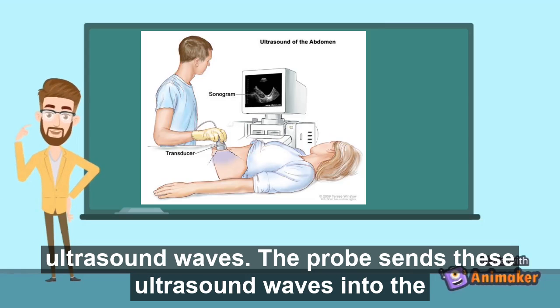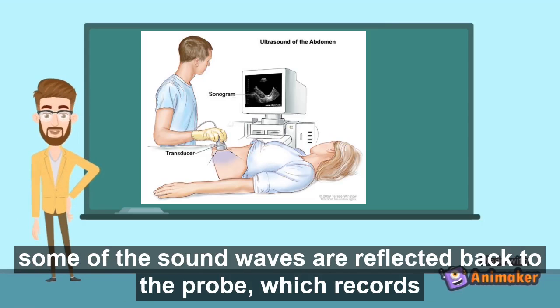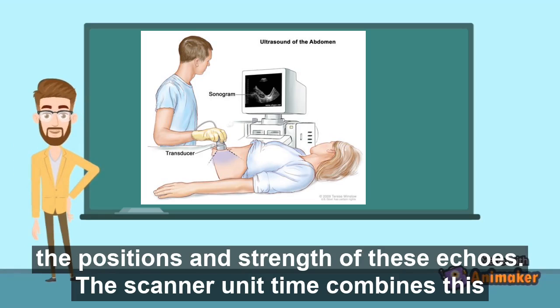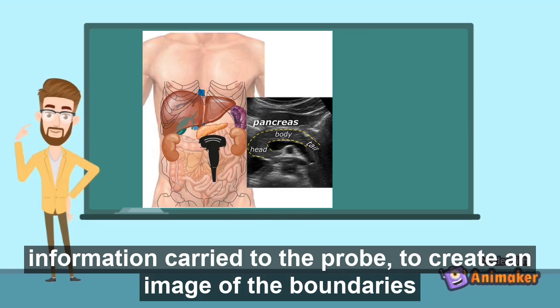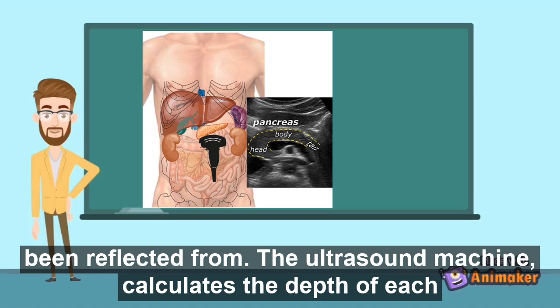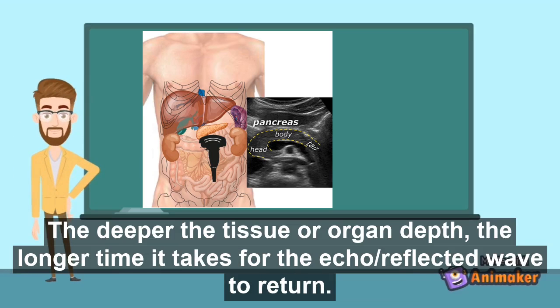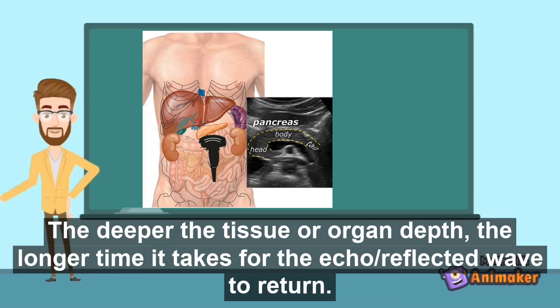The probe sends these ultrasound waves into the patient's body. At each boundary between different tissues or organs, some of the sound waves are reflected back to the probe, which records the positions and strength of these echoes. The scanner unit combines this information carried as echoes to create an image of the boundaries of different tissues and organs. The ultrasound machine calculates the depth of each boundary by measuring the time taken for each reflected wave to return — the deeper the tissue, the longer it takes for the echo to return.